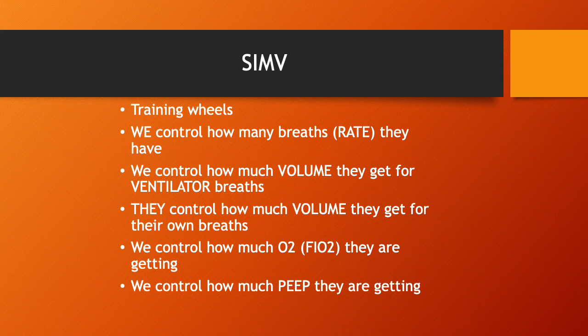Now let me clarify this real quick. So, when I have a set rate, no matter what mode I'm on, effectively the ventilator is set. So let's say my rate's set to 12. That means every minute I am going to have 12 ventilator breaths, which means there are 12 breaths given by the ventilator. So that means they are giving me so much volume, so much support, so much push to get that in. It's always going to be the same. Those breaths are going to be the same.